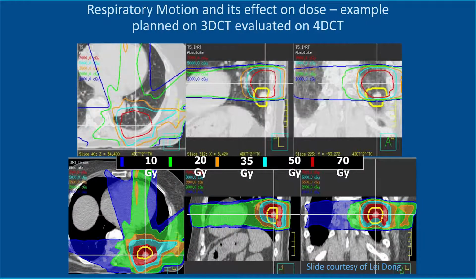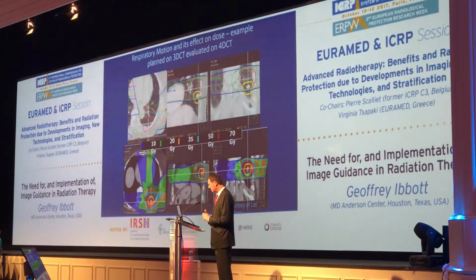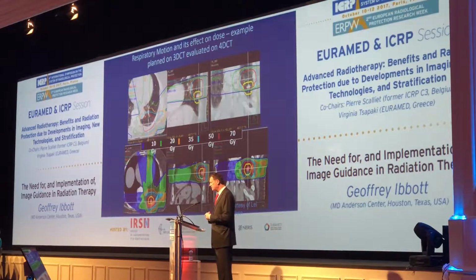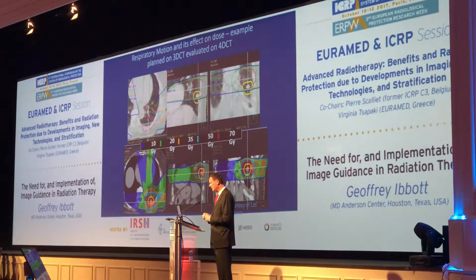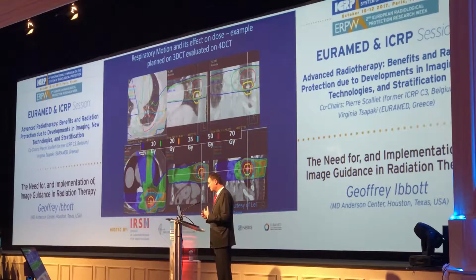Now, I've mentioned motion, but what I haven't talked about is respiratory motion. And of course, that's not the only kind of motion that can affect the movement of tumors and target volumes, but it's critical. And here is a good example in the upper panels of a treatment plan that was prepared for a patient with a lung tumor that is shown outlined in yellow here, showing that on the actual day of treatment, the tumor was not in the volume receiving the high dose. And again, my previous slide showed the effects of rectal filling, and similar effects are seen with peristalsis.